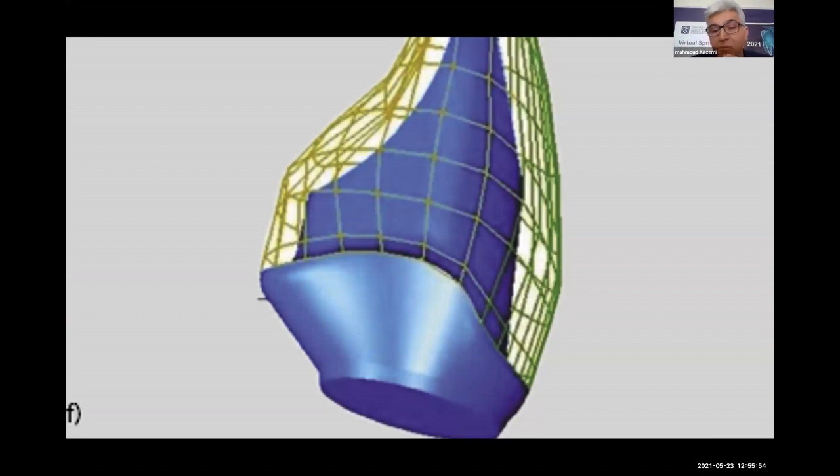A customized abutment is an abutment made for a prosthesis in an implant patient, with the marginal level following the gingival level of the implant, and the height exactly right for the prosthesis which should be made on it, with enough tapering, and proper contours for the prosthesis with the best emergence profile, and with the best angulation to correct the angulation of the implant so it becomes a straight abutment that a prosthesis can sit on.